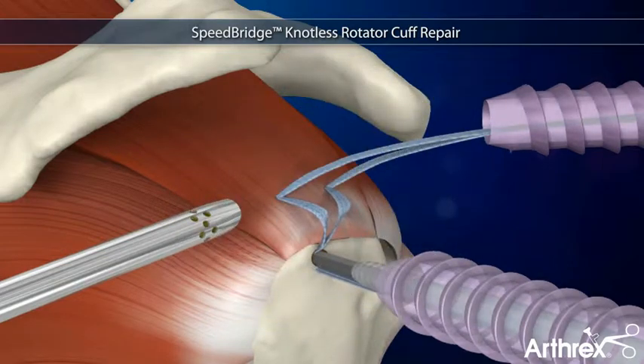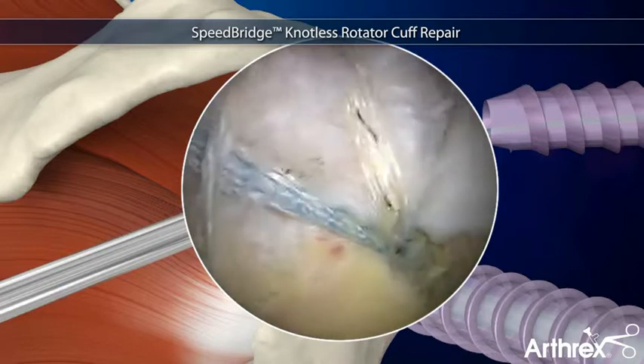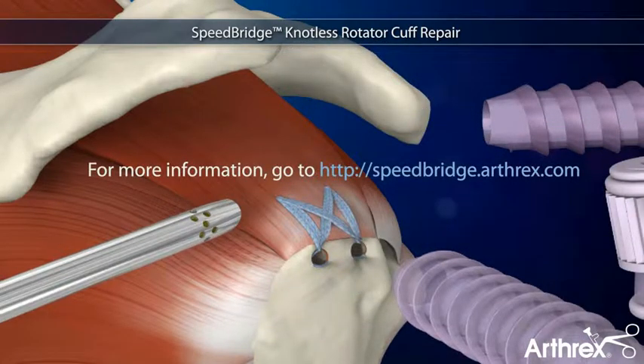The fiber tape tails are fixed laterally with additional swivel lock anchors, completing the totally knotless repair, which enhances footprint compression to maximize contact between tendon and bone.